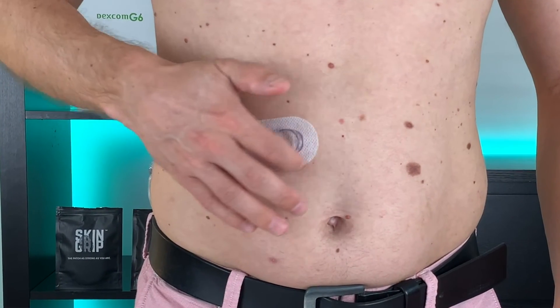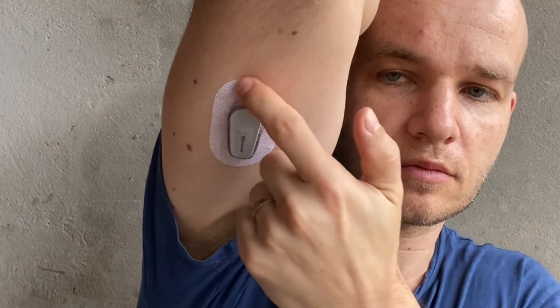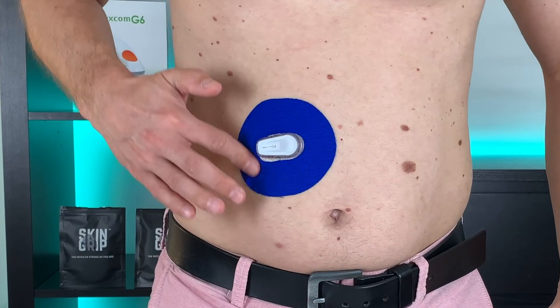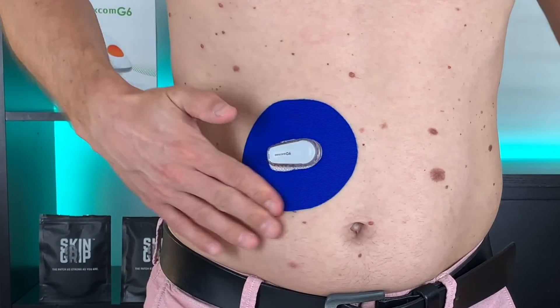For me the upper arm works much better than the abdomen. When I place the sensor on my belly, the patch starts to come off after a few days. On the upper arm it stays on much better, and I think it's because the abdomen is subject to much more movement — it's constantly stretching and shrinking as we sit down, stand up, or rotate our body. And when I take a shower, the water running down my belly makes the patch peel off really quickly. So for me the upper arm wins.